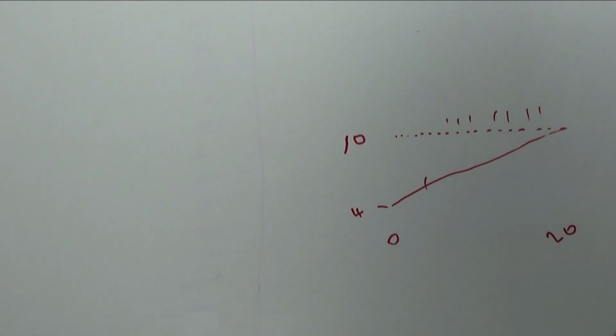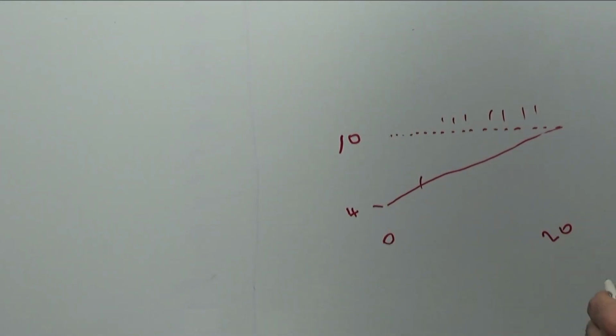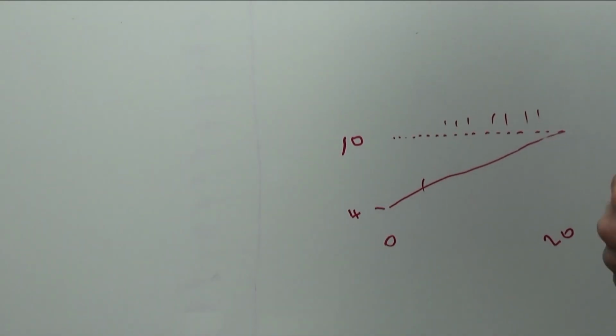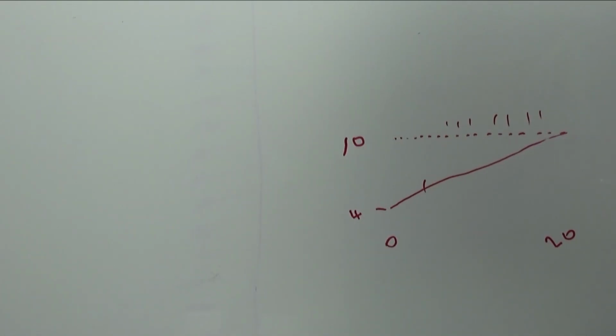Now every time you turn the machine off and turn the machine back on, it's going to reset that ramp time. So in general, I typically tell people to leave the ramp off because it tends to cause more problems than it solves. Now, the caveat to that is if you're going to take the mask off and just not wear it because you get used to the pressure and you can't fall asleep with it, then by all means use the ramp. Otherwise, I'm just not a big fan of them.